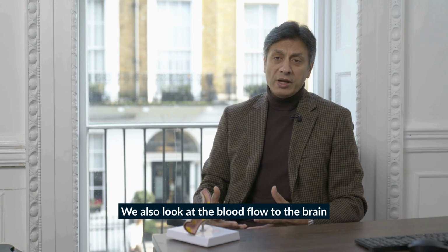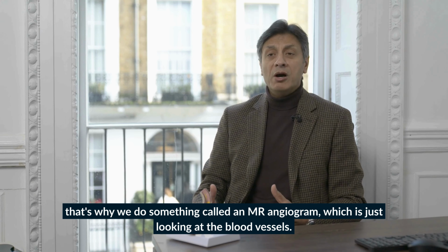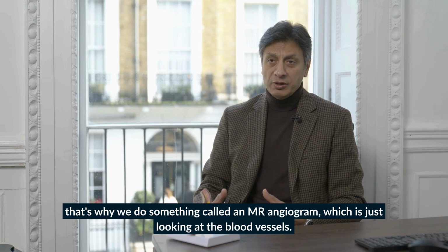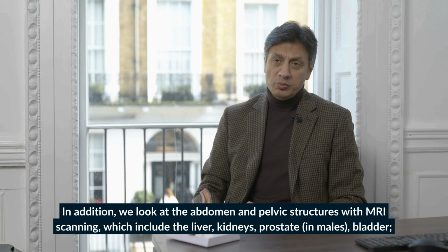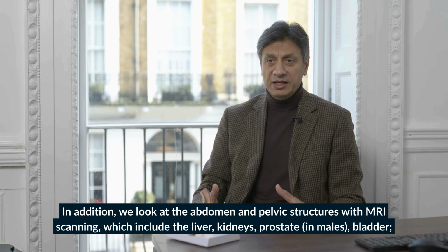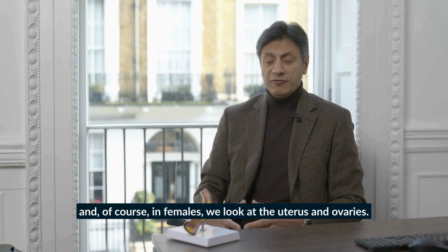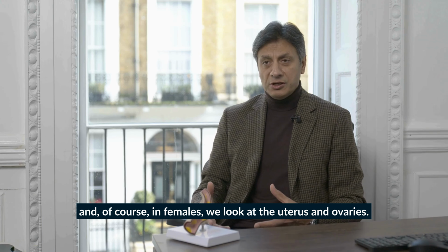We also look at the blood flow to the brain. That's why we do something called an MR angiogram, which is just looking at the blood vessels. In addition, we look at the abdomen and pelvic structures with MRI scanning, which includes the liver, kidneys, prostate in males, bladder, and of course in females we look at the uterus and ovaries.